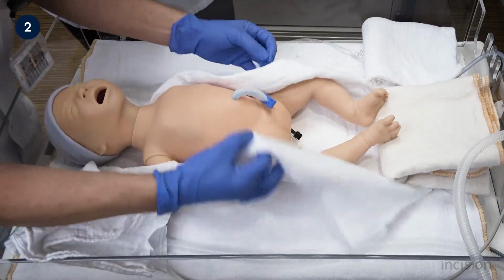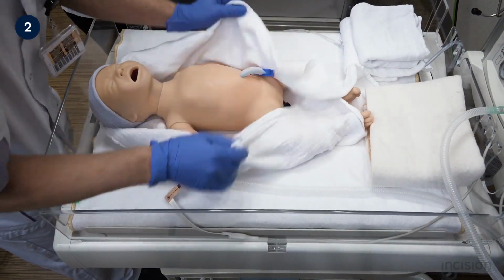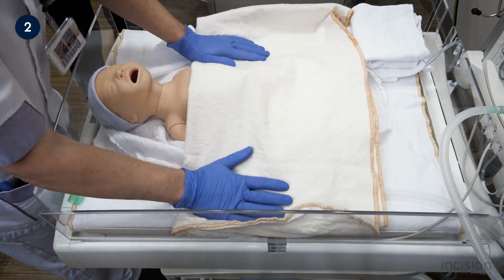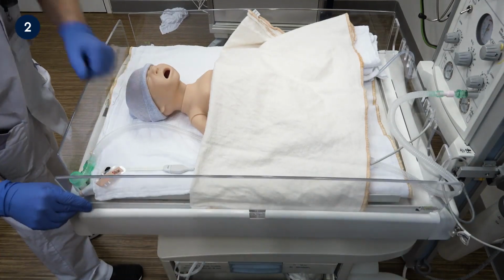Towel drying will often stimulate breathing, as shown here. The newborn is then wrapped in warm, dry towels. The head should be covered with a hat. Aside from drying, a drop in neonatal body temperature may also be prevented using the heater of the resuscitation unit and keeping the panels up.